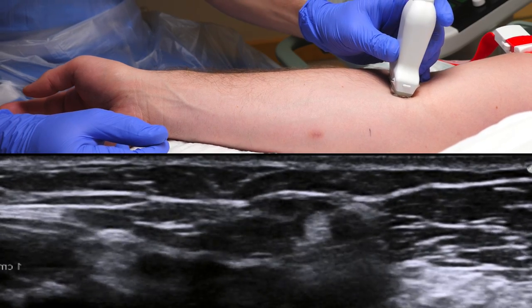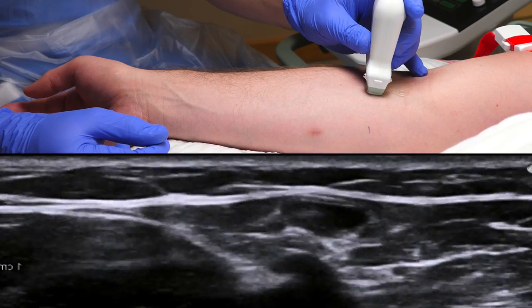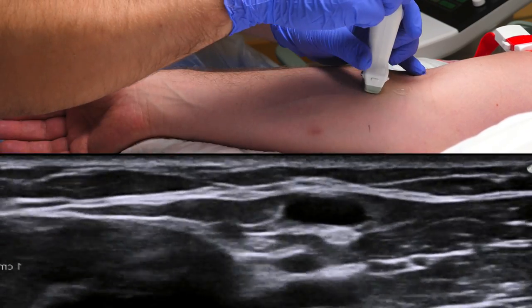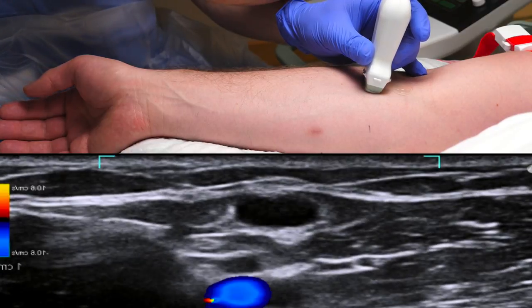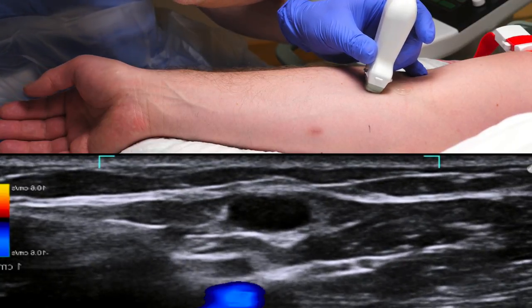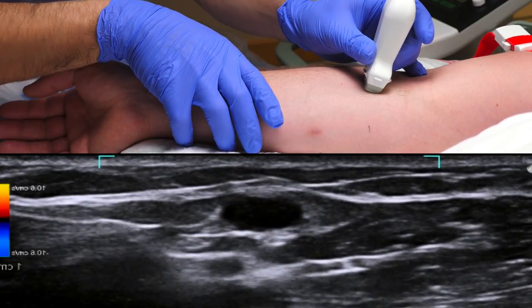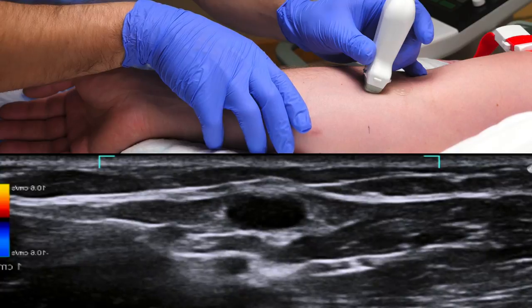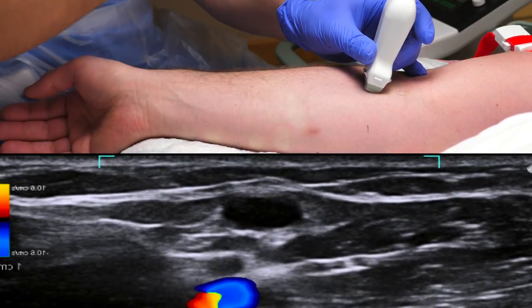Start by compressing it — it should be easily compressible. This is usually sufficient, but if you wish you can use colour Doppler to confirm a non-pulsatile flow. The black void in the middle of the picture is a vein, and the deeper flashing structure is an artery. Compressing the distal arm causes pooled blood to rush up, which we can see as a flash here, further confirming that our target is indeed a vein.